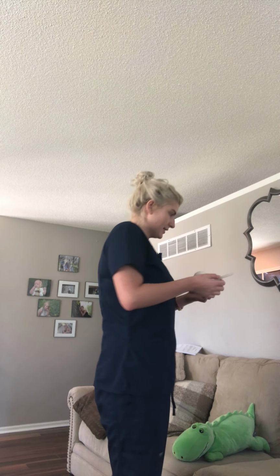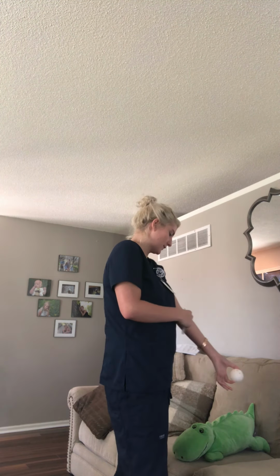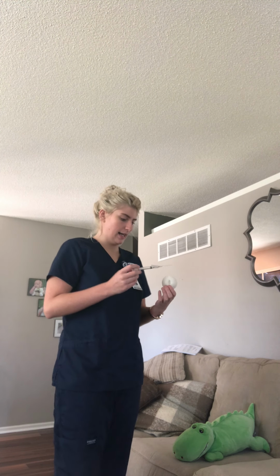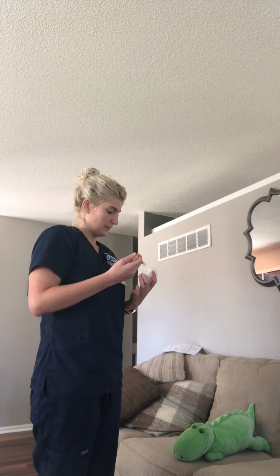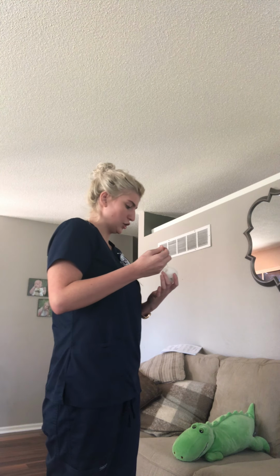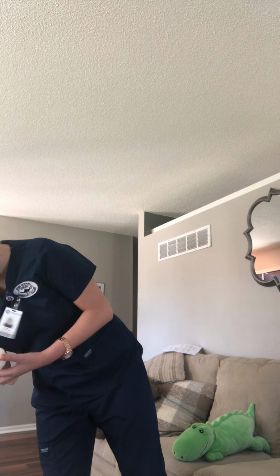So after you do that, you need to clean with the alcohol swab in a circular motion and outward. And then after that, you can inject your medication. So take that, and it needs to be at a 15-degree angle, bevel up. And then you can just inject like so. And then you need to activate the safety handle immediately, and then dispose in the sharps container.